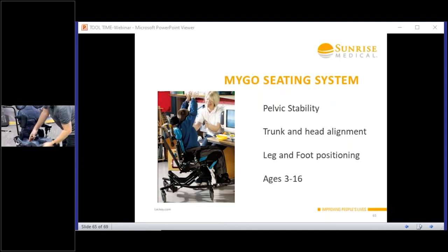And then moving from rotation, you've then got levers underneath. So they've got a button on the side of them. Show you that. And then with that, you've then got the length. So you can manage abduction, wind sweeping, leg length discrepancies. Okay, you can also build up for obliquity under the pad. We can do some ramping and that sort of thing and create an ischial shelf.